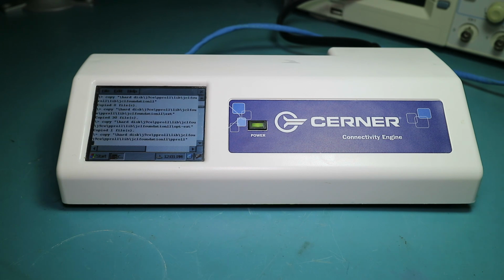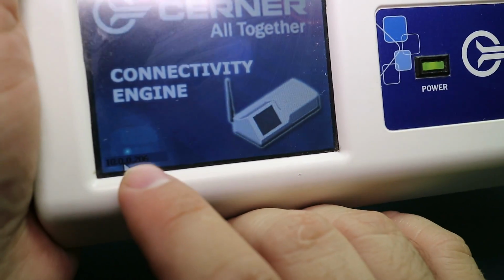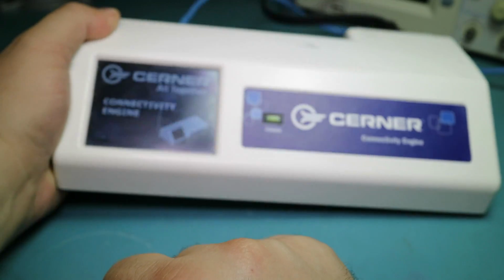secure web server. The secure web server doesn't seem to do anything, but the plain web server just goes, "Oh, you've installed Windows CE, here's your generic nothing website." But it's also providing an FTP server and a telnet server. So, here's the software, it just came on, and maybe at the bottom you might be able to see that it actually says the IP address, and that's pretty much all you can do from this. It doesn't really do anything.